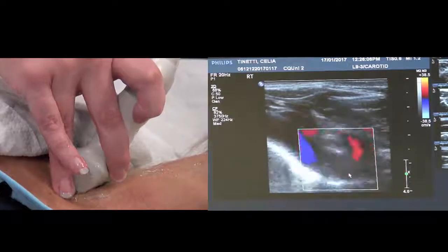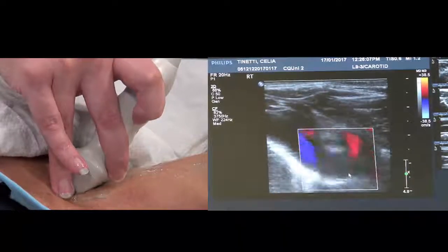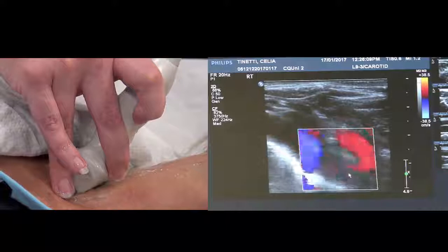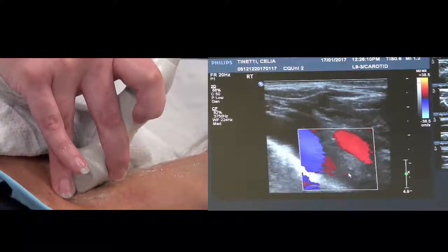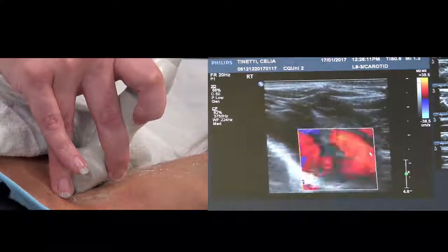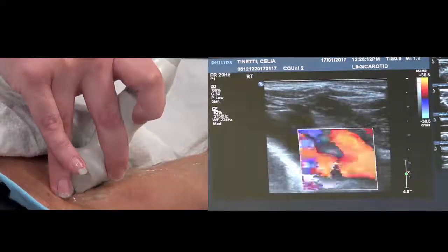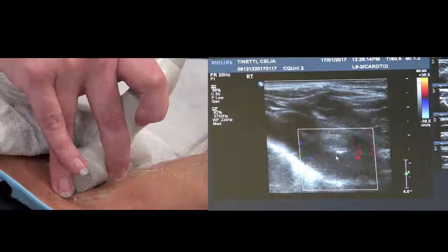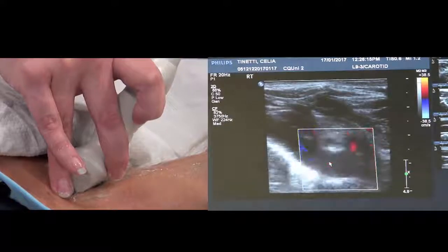I know that a lot of people last year got all panicky, but really we just want to see that you can look at this area. There's no way I'm going to get a 60 degree angle through there, so this is what I'm going to use. I'm going to drop my pulse wave down here.